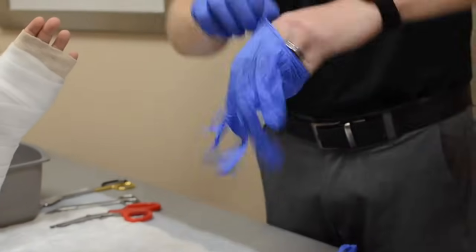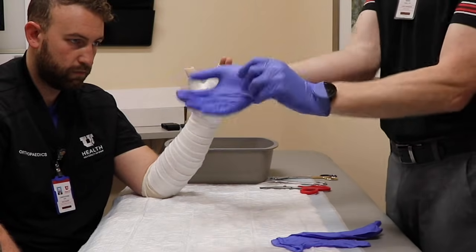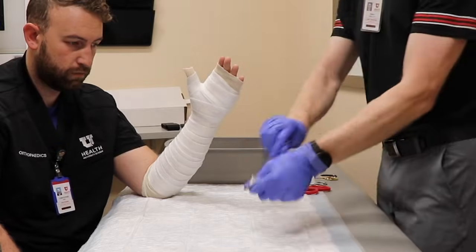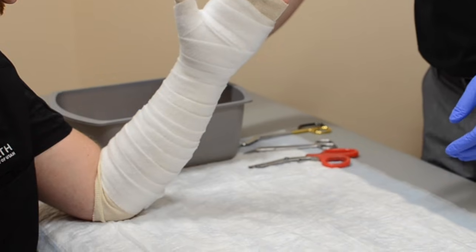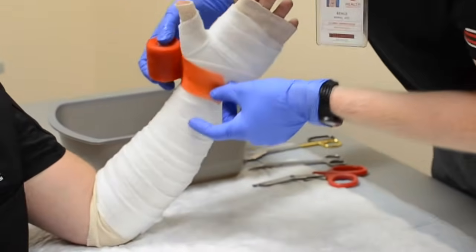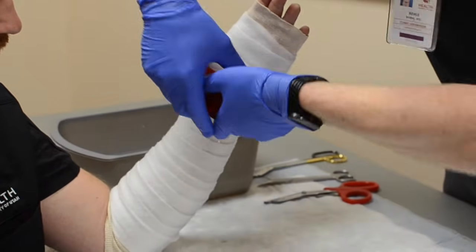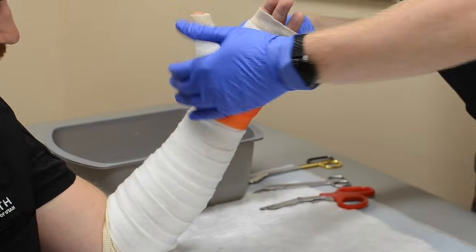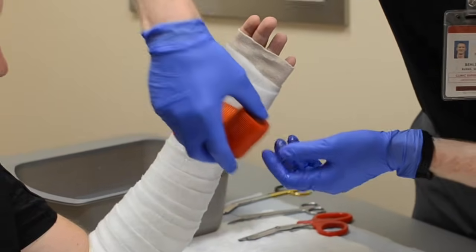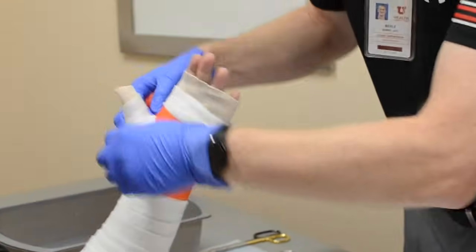I like to use two sets of gloves. If anyone in healthcare knows, I take off my one set and I want to put my other set on but I'm sweating underneath and you can't get that next set on. So the two sets will just make it easier later on. I'm going to do two layers of the cast tape and get it wet. Again, I'm going to start right at the base of the wrist, just laying it down — I'm not pulling tight at all. Just like the padding, I'm at 50% coverage. I'm going to go just behind the MCP joint, right below the MCPs of the fifth digit, and as I come up, I want to make a cut so I can go around the thumb.